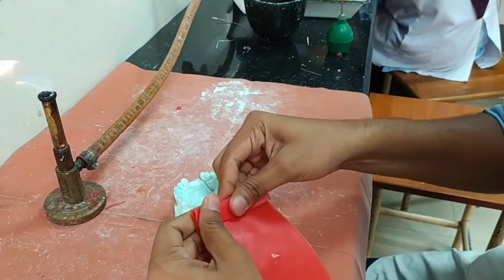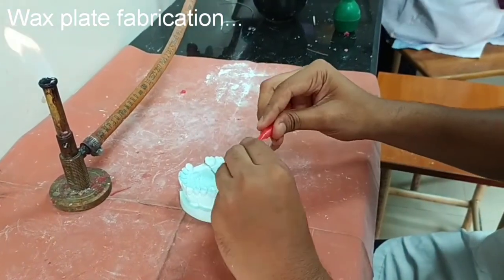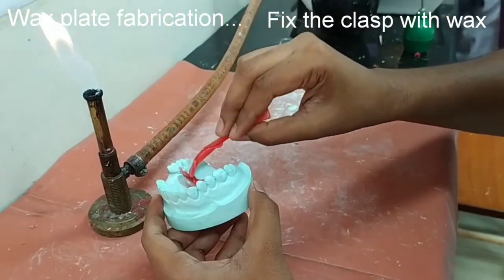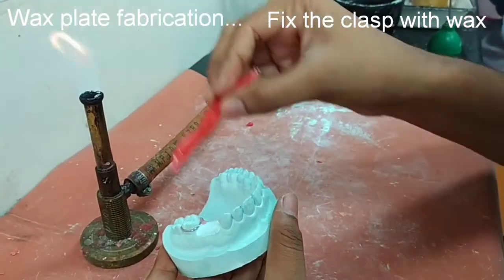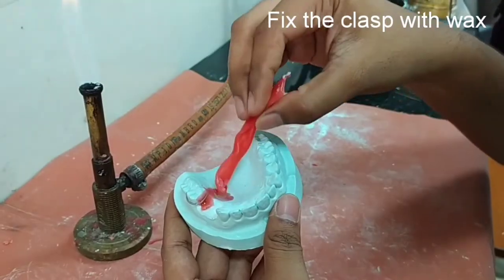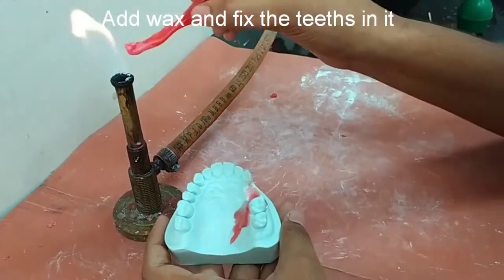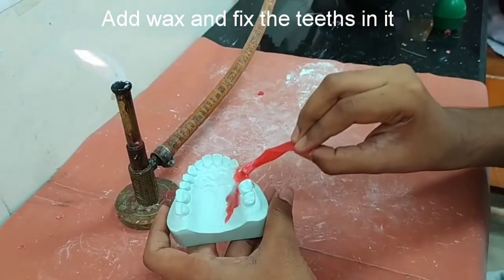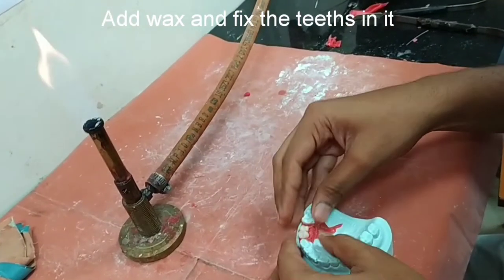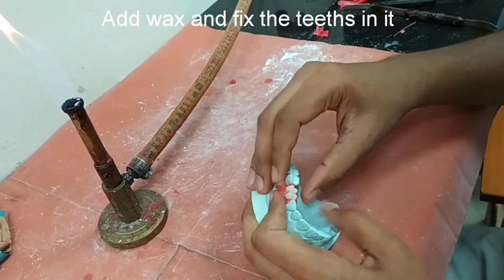We will put wax on the tag arm and the above portion. Except the C-arm which is on the buccal side, we will seal all other portions of the clasp so that it does not move during the denture-making procedure. Add wax on the filed portion, fix our acrylic tooth in it, check the occlusion, and seal it properly.